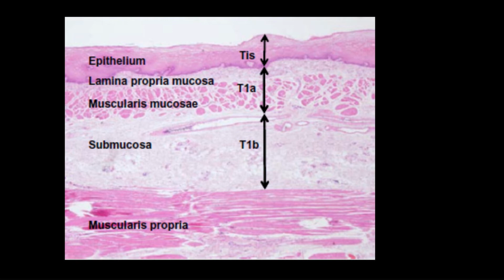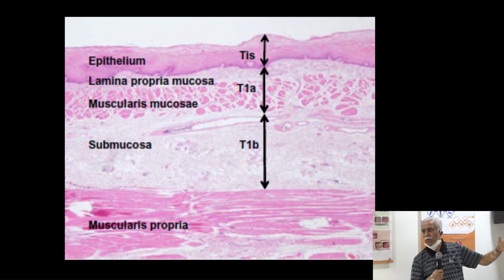But when we do endoscopy, we are really trying to focus on these layers here to find out changes. This is in situ lesions, this is T1A, T1B. So this is all T1. In oncology, I think this will be early. But how early, whether it's endoscopically resectable, will depend. Endoscopically resectable would be this, somewhere here. If it comes here, that means it's closer to the muscularis. So understanding this and familiarizing yourself with these terms is important, because everyone keeps talking about T1, T1A, and so on. But this is what it really means.